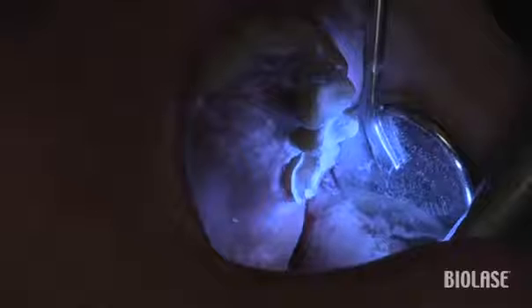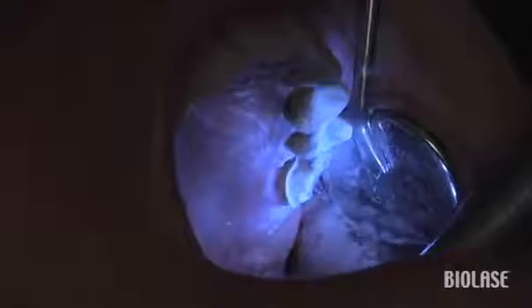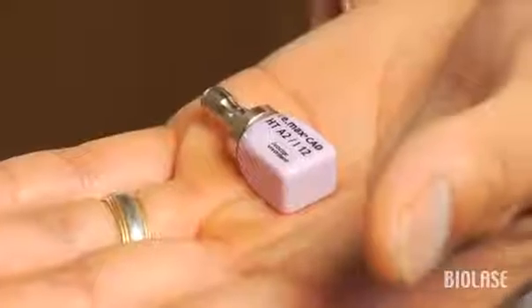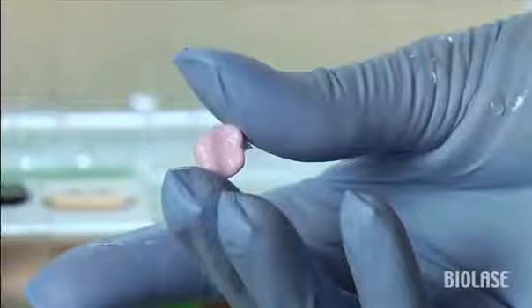As I am taking the image for the CAD/CAM, you can see the screen in the background showing the clearly delineated margins. This will help you achieve a beautiful fitting restoration, whether you are taking an impression or an image. Here is the crown after it has been milled and before we sinter the restoration in an oven. During this phase, it will achieve maximum hardness and change color to the shade you have chosen.